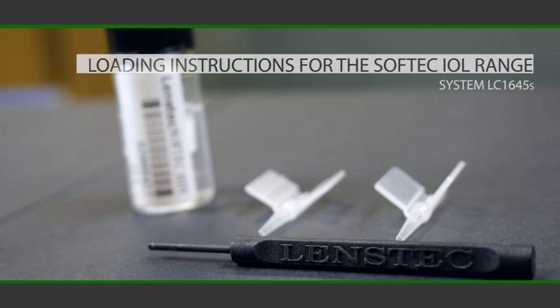Loading instructions for the SoftTech IOL range, System LC1645S.